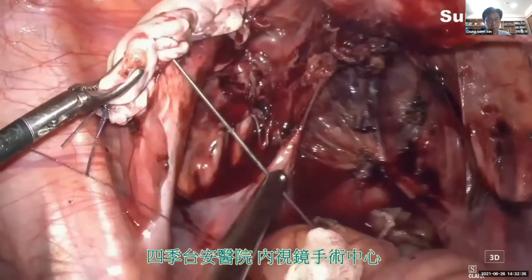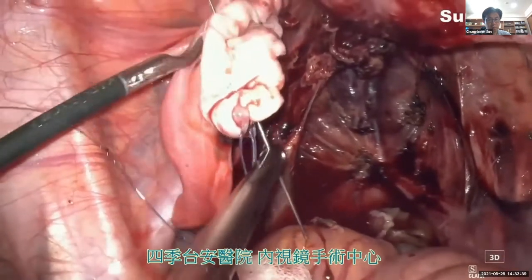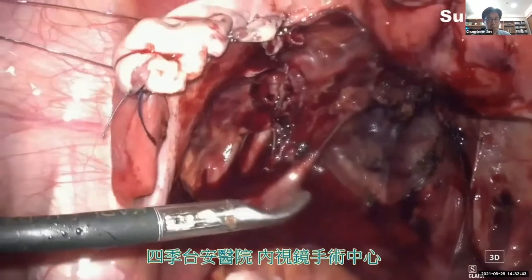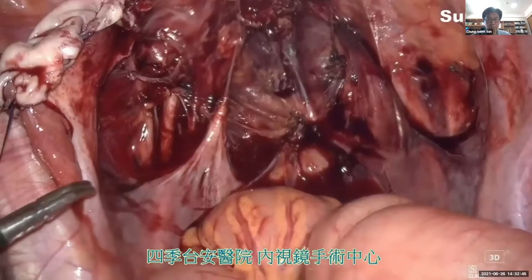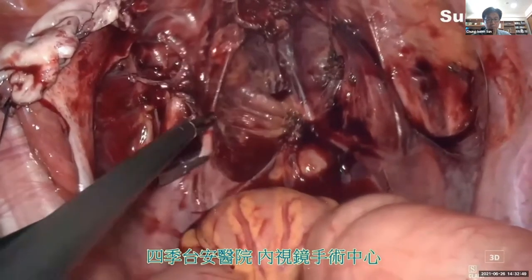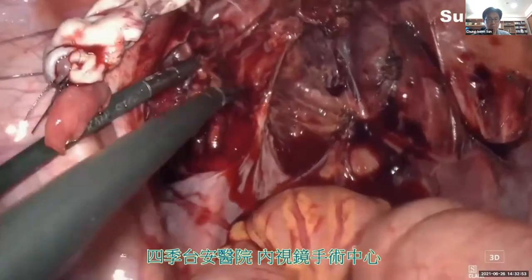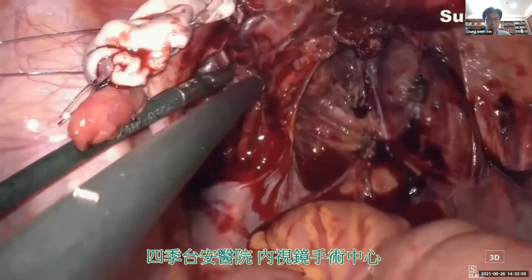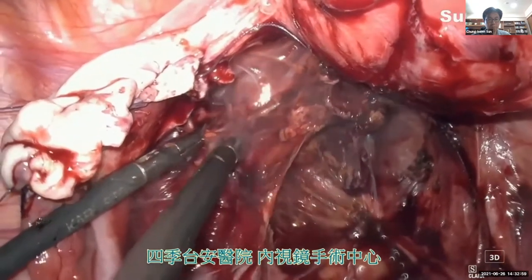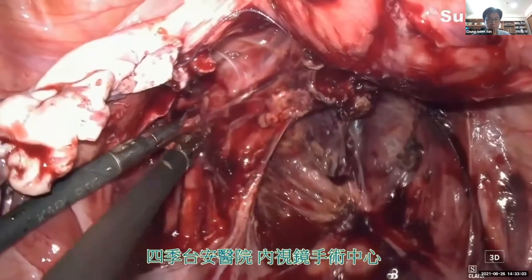Now we suspend the ovary, then we can approach the ovarian fossa very easily. Now we are going to remove the fibrotic tissue, which also contains some endometriosis lesions above the ureter and the uterine vessels.